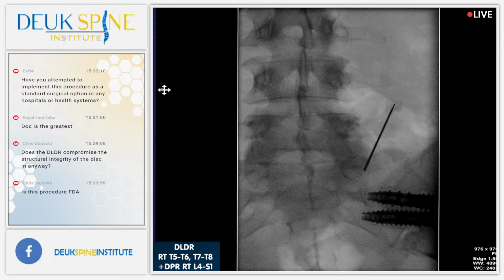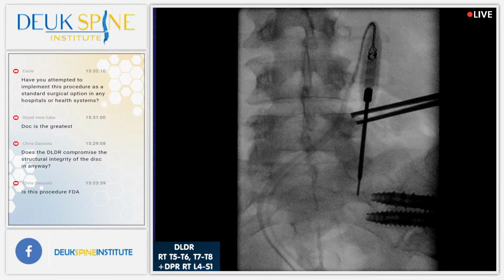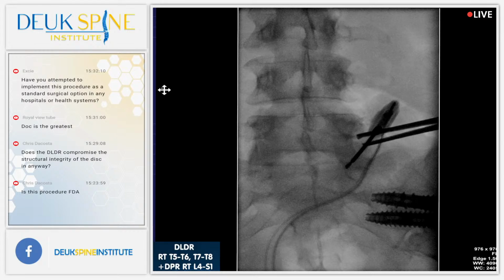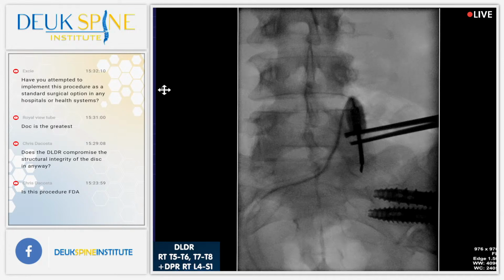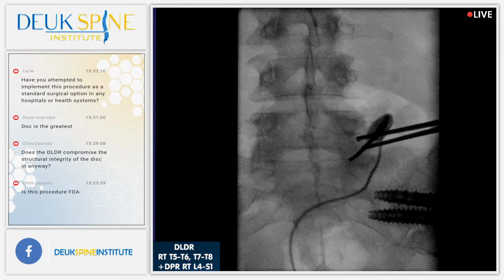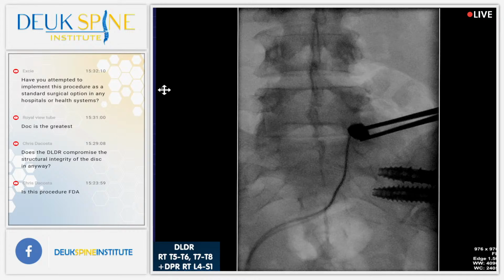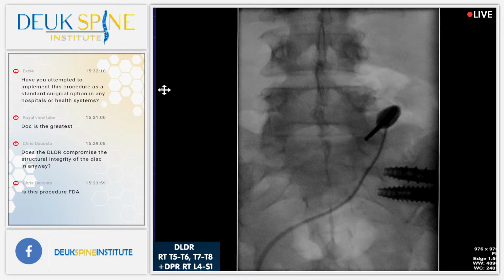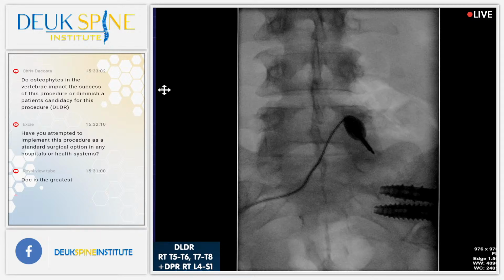Just need to get down to the sacrum for this last week. It's really a burn, by the way. Too low. We're actually burning the pain nerves. Shot. Too low. Shot. Too medial. Shot. It's almost good. Shot. That feels better. Nope. Still not good enough. Shot. Too medial. Hey, watch the scope there. Shot. All right, let's see. Shot. Nope, too medial. Shot. Shot. That's really nice, actually.